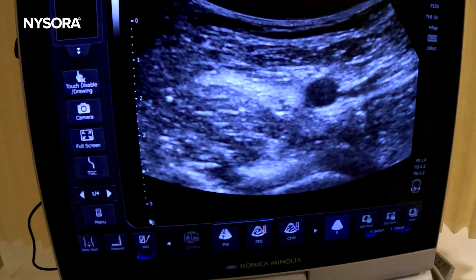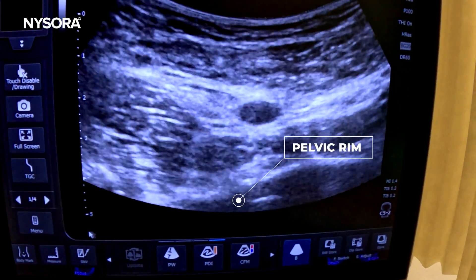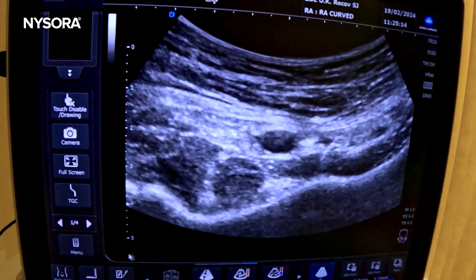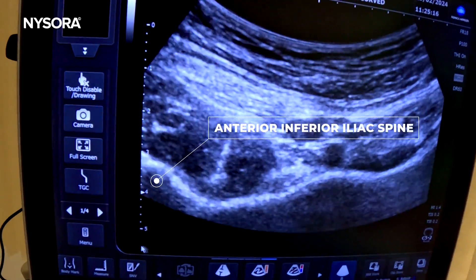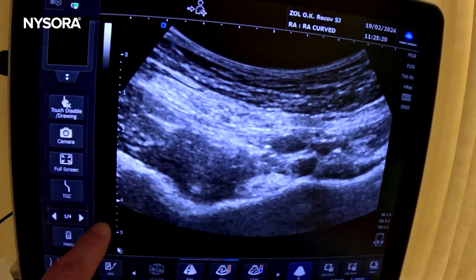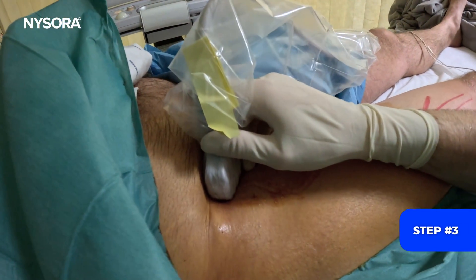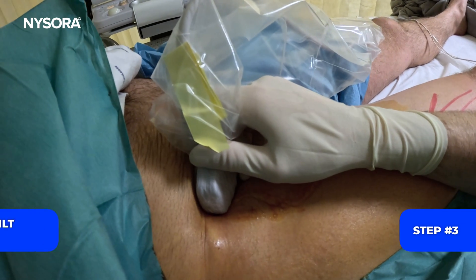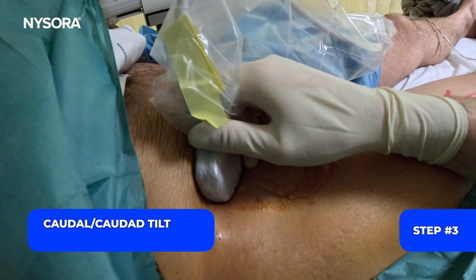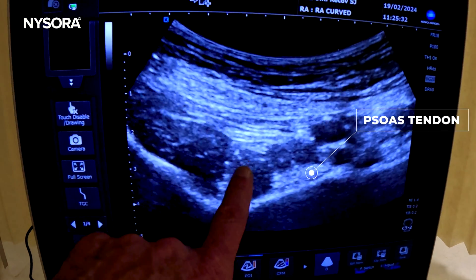We start seeing the pelvic rim up here — keep going up. That's the anterior inferior iliac spine; it's the pelvic rim right here. Once we get to this point we stop. Now step number three is a slight caudal tilt to emphasize the iliopsoas tendon.